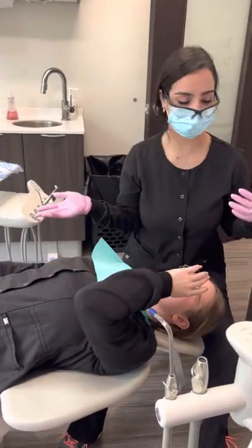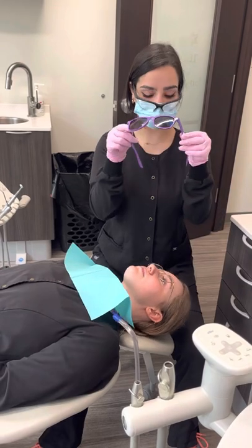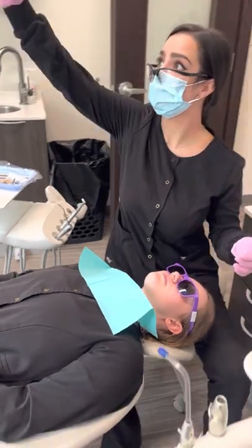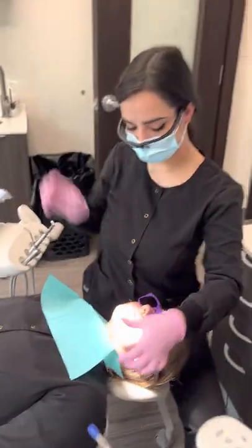Typically we do this when the patient is sitting up, but just for this video's purpose. We're going to make sure that we select the correct glasses, making sure that we are in the correct position. We're going to turn on our light and angle it at the patient's mouth.